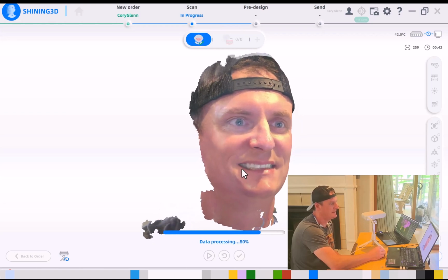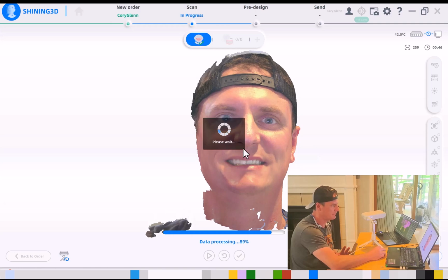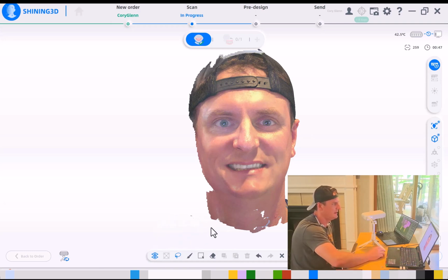All right, so I didn't capture a ton, I'm doing this on myself and it's a little awkward, but that's perfectly fine for what we need to do here. You can cut out any data you don't want and delete that, and that looks good.